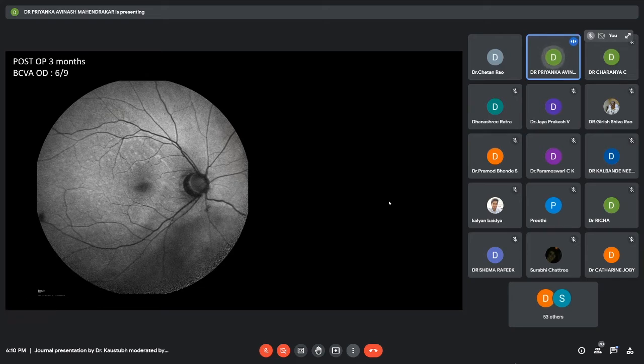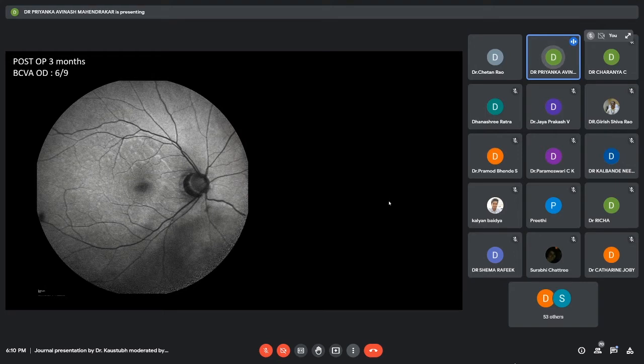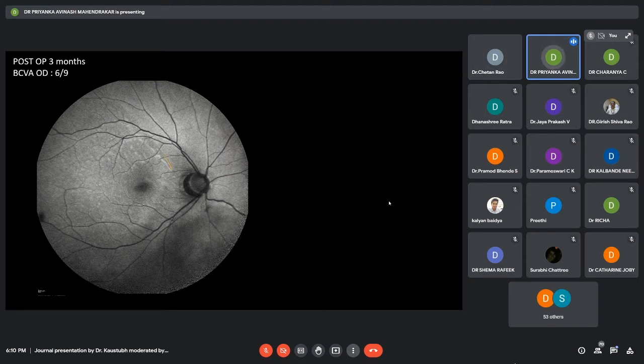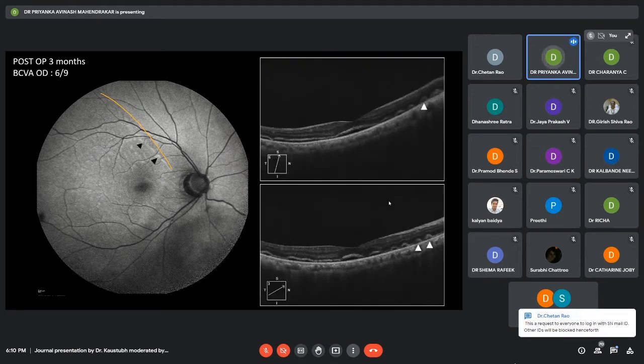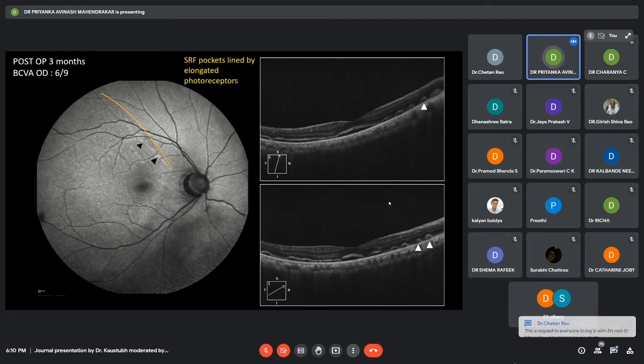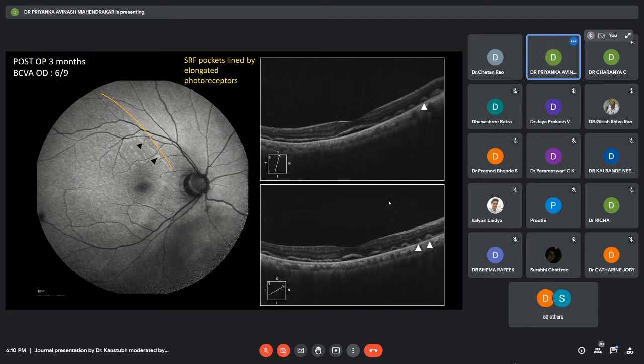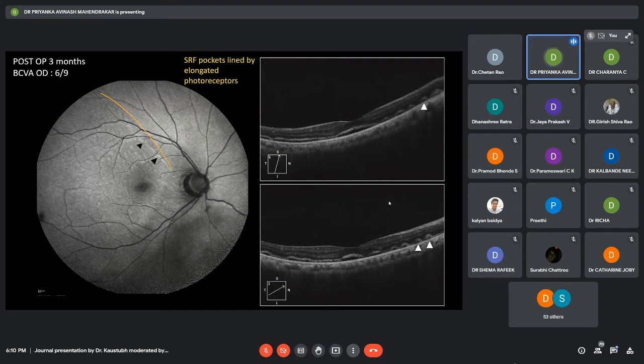Here is the post-operative three-month autofluorescence image of this patient. The best corrected visual acuity at this time was 6/9. Here, we can see a clear distinction between the attached and the detached retina. Also, we can see certain hyper-autofluorescence lines, which were correlated on OCT with SRF pockets, which are lined by elongated photoreceptors.